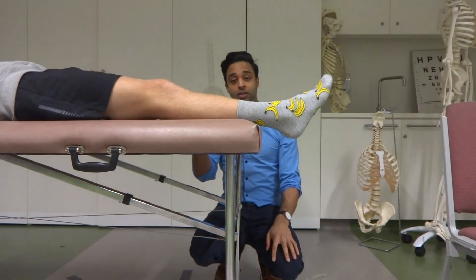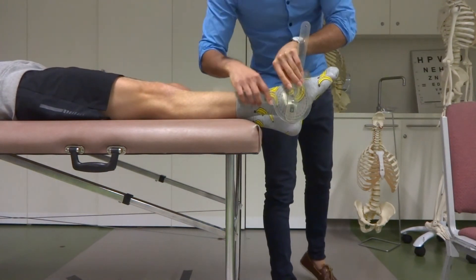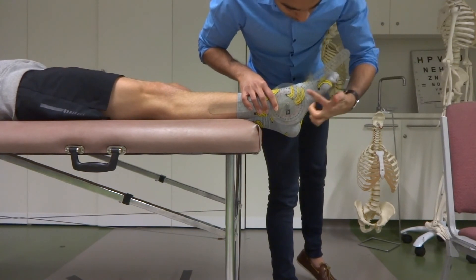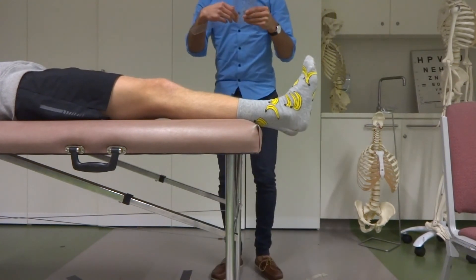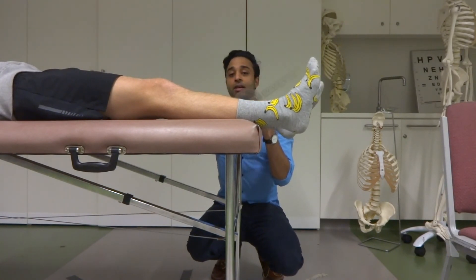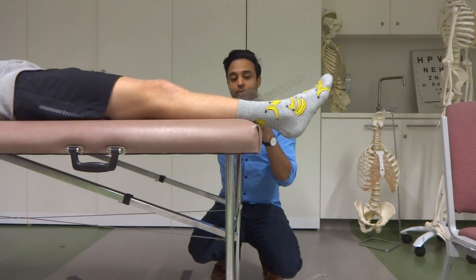For ankle plantar flexion, it's the exact same landmarks. I'll ask Jack to plantar flex his ankle as much as he can. Using those same landmarks — along the axis of the lower leg, on the lateral malleolus, and parallel to his fifth metatarsal — I pull that away. If I look at the black values, it says 145. But looking at the red values, the actual answer is 55 degrees, because that 90-degree-looking position is actually zero degrees — that's anatomical position.